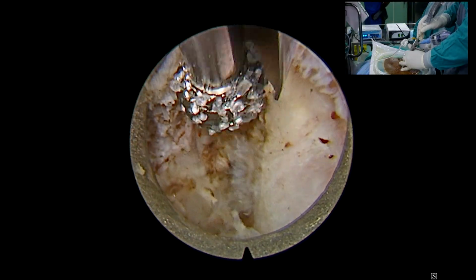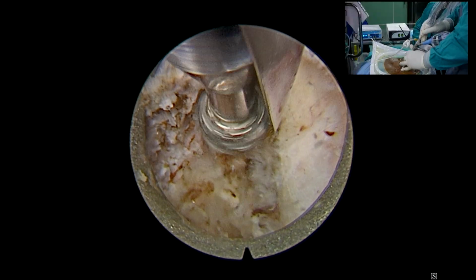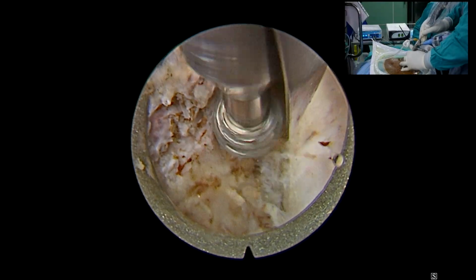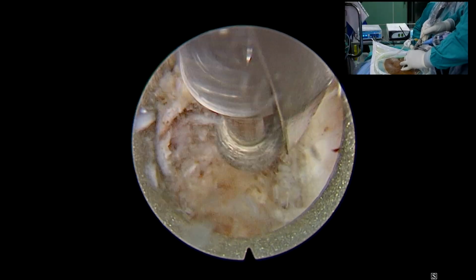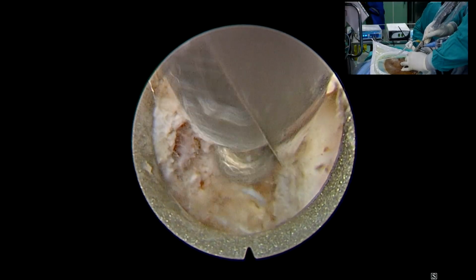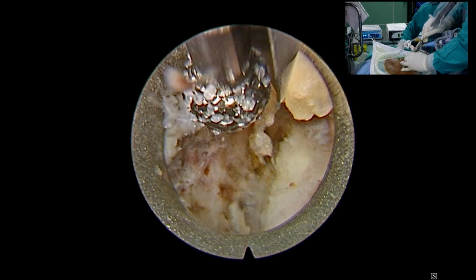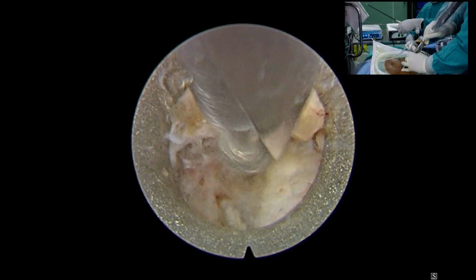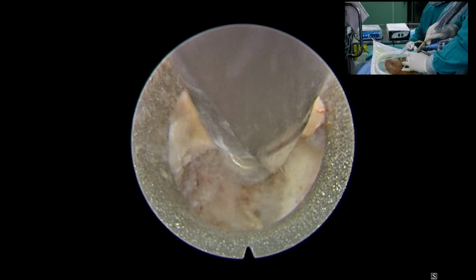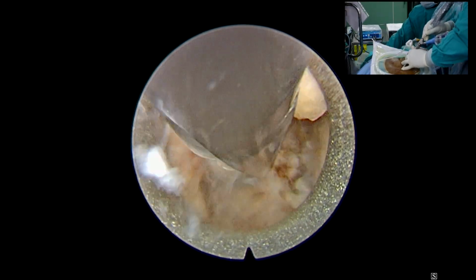Do not connect suction in this. Clamp the suction and keep the burr. It is the diamond burr. So it is not a cutting burr, it is a diamond burr with side protection. There are many variations in burr systems: one is a cutting burr, one is a diamond burr, one is a diamond side protecting, and one is diamond tip protecting. See, it's gone inside.